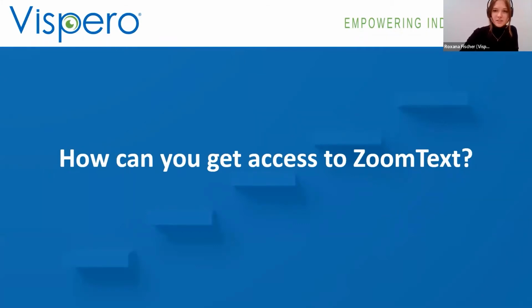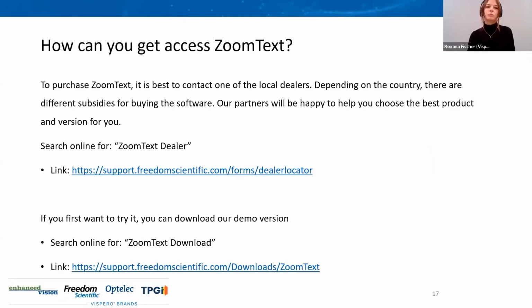So how can I get access to ZoomText, especially for Europe? How can you get access to ZoomText? For most countries it's different. So if you are interested in ZoomText, I would suggest you to talk to your local dealers, distributors, how you can get the software, if there are any subsidies that you could get before buying the software yourself. But if you want to first try it out and run a demo, it's available on our website under Downloads and ZoomText.